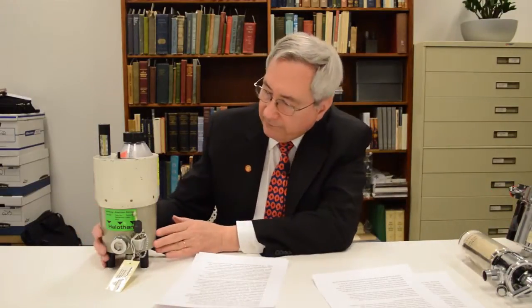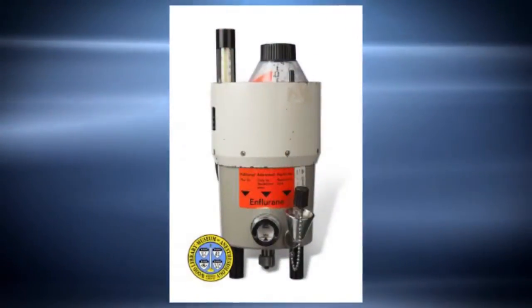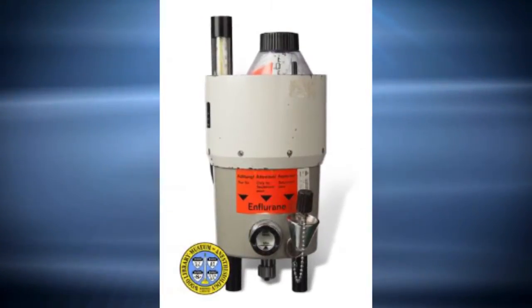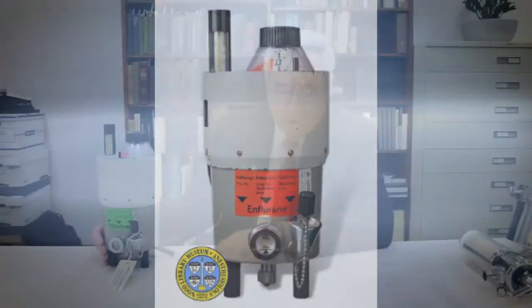So the third vaporizer that I have today is the Dragerwerk Vapor from 1958. It's of West German manufacture with distribution in the United States. Like the Fluotec 2, the Vapor is an agent-specific vaporizer with temperature compensation. It too is designed for use with halothane only. There were certainly variants of these used for other anesthetic agents. However, the Vapor provides for temperature compensation in a way that is different from the Fluotec Mark II, which had the bimetallic strip in it.